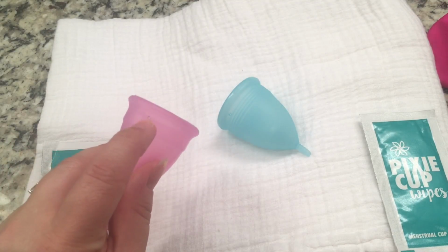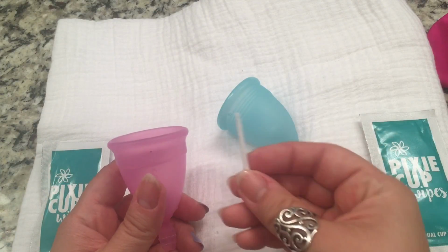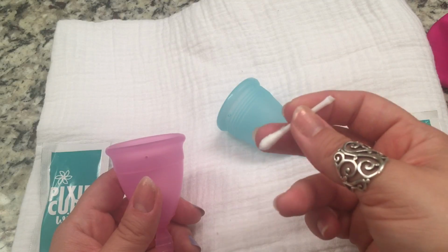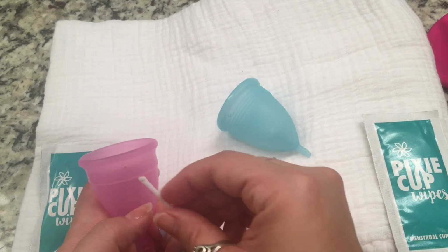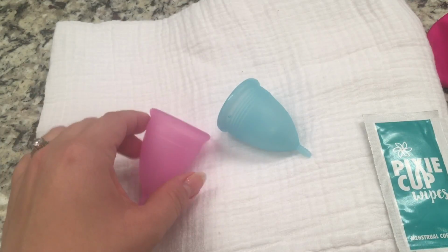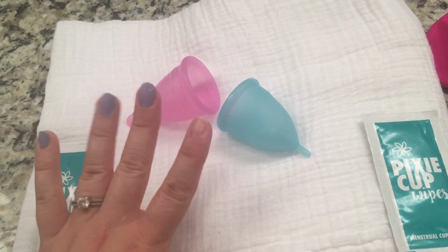As far as cleaning these little suction holes, I did find that if I'm not careful, some dried material can get there. So here's my little hack for that. I take a Q-tip, but the cotton part of the Q-tip won't go through, so I cut one in half and I use this hard plastic, that'll poke through, and then you can clean that. So from my experience, I really, really, really like using these so far.